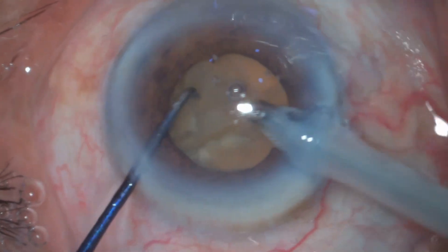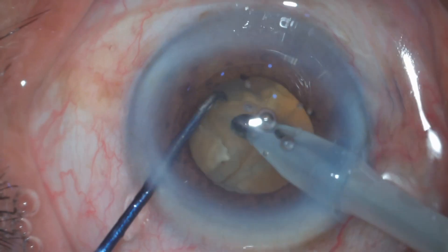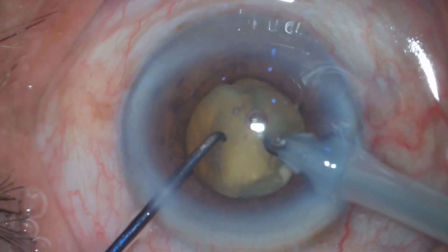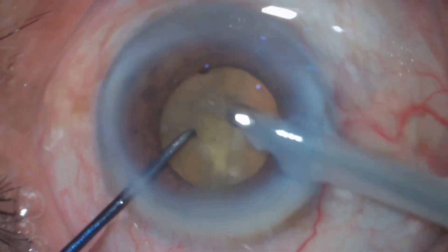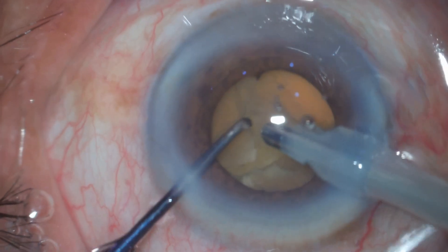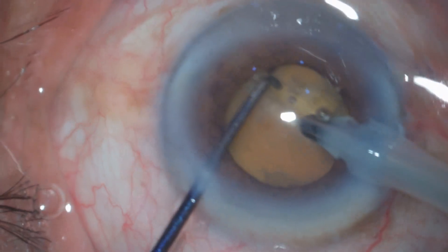In these kinds of hard and slippery nuclei, I just make a partial crack — I don't separate the posterior plate. I remove and work on the nucleus first, using the posterior plate as a scaffold to prevent posterior capsular tear. I'm separating the endo nucleus like peeling an onion, burying my phaco probe deeper into the nucleus.